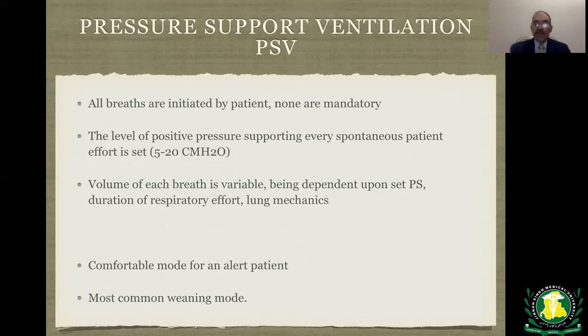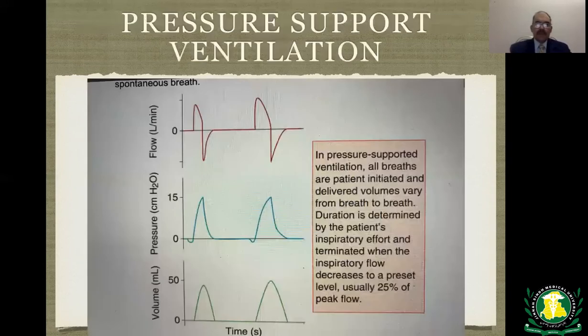It's a very comfortable mode for an alert patient because they can breathe at whatever rate they want, and whatever tidal volume the patient wants, and it's the most common mode of weaning. As you can see in this pressure waveform, there is a negative deflection before each breath, indicating all these breaths are generated by the patient.